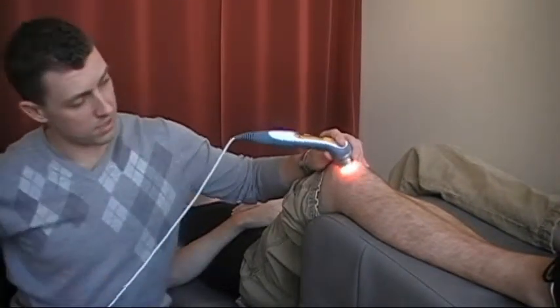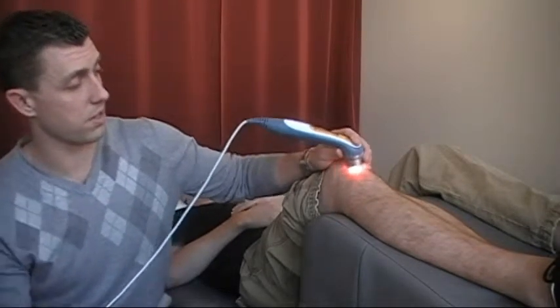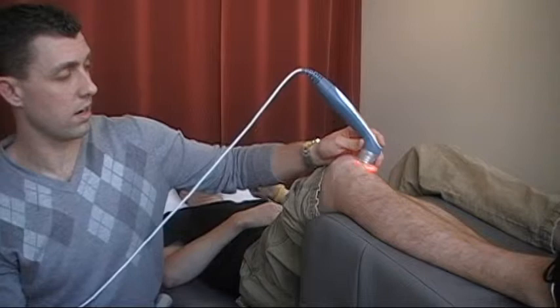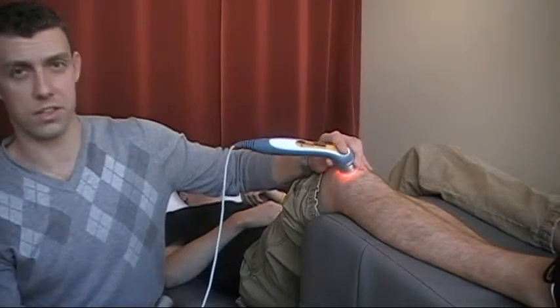You may be able to see in the video there's a little bit of red light. This is cold laser, so actually no heat is generated. We hold it just above the skin and angle it — in this case, we'd be angling it right into the soft tissue and into the joint.